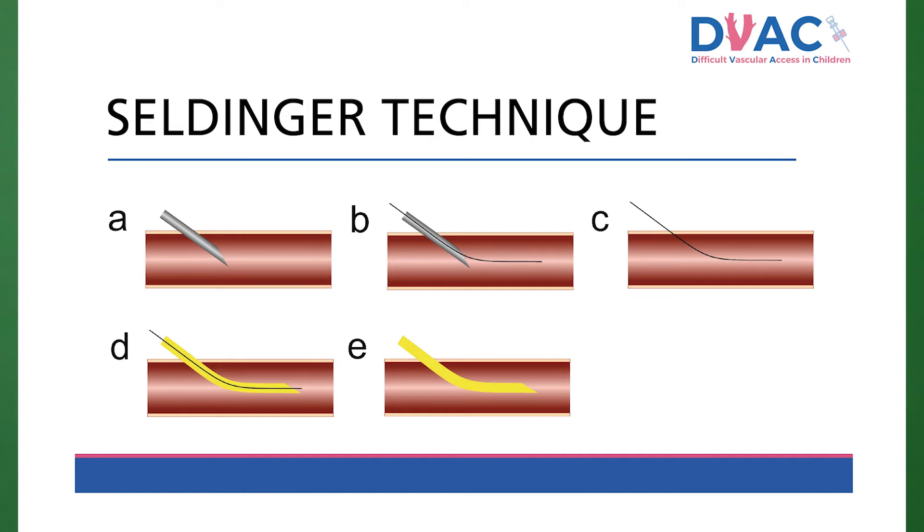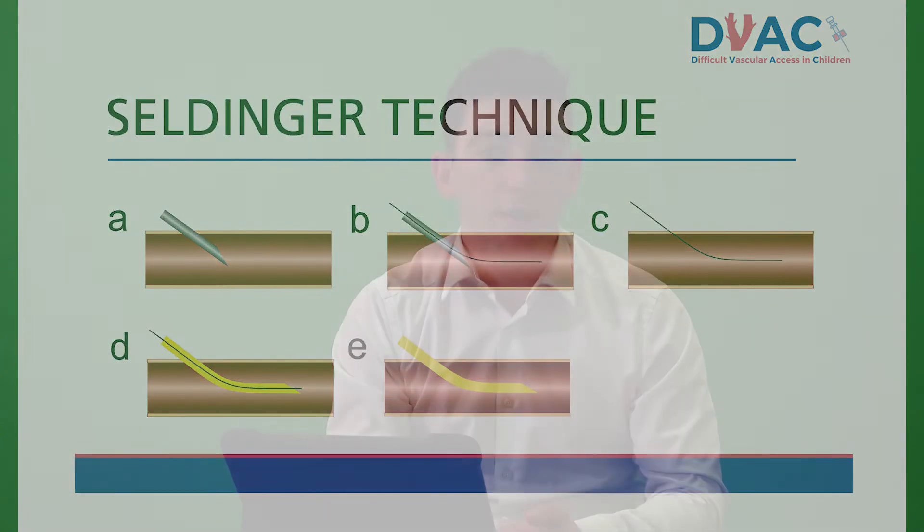This step is often very tricky when trying to get past the skin as the fascia can be tight. It may require some pressure and manipulation to get the midline into the vessel, then it should advance up the vein easily. Step E: remove the guide wire, then ensure it aspirates and flushes well.